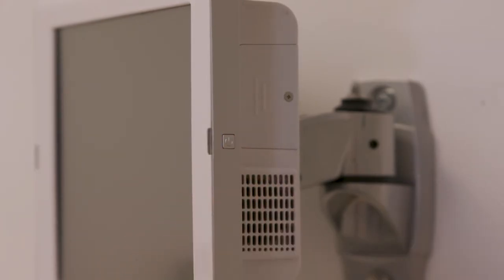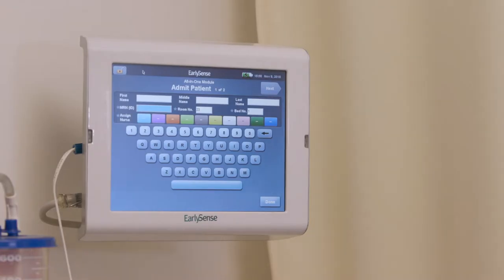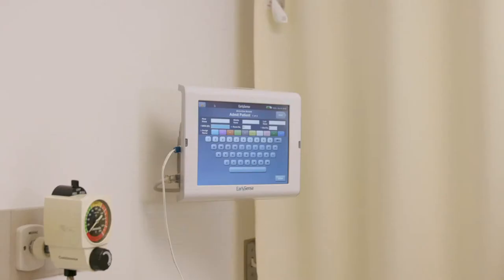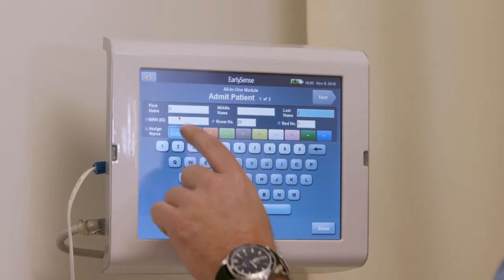The two indicator key lights will flash blue lights. After the EarlySense app is successfully running, the Admit screen will show. The Admit patient screen appears on the touch screen when the system is turned on and will remain there until a patient is admitted. To admit a patient, simply enter the patient information on the Admit patient screen.